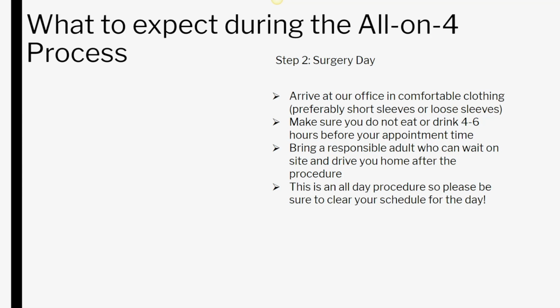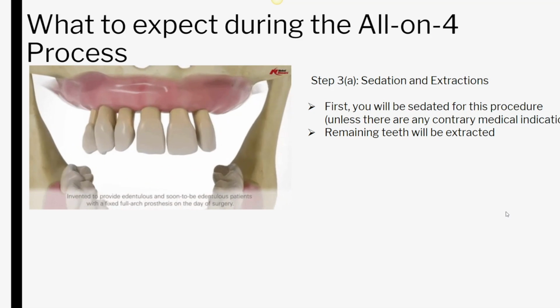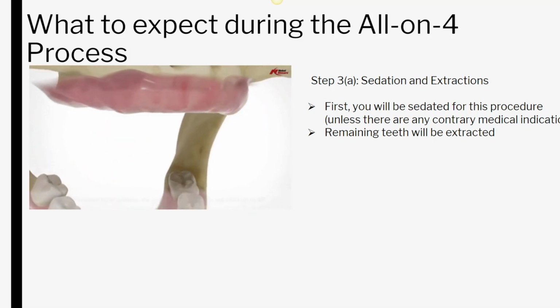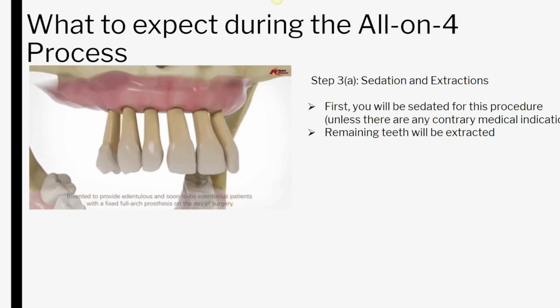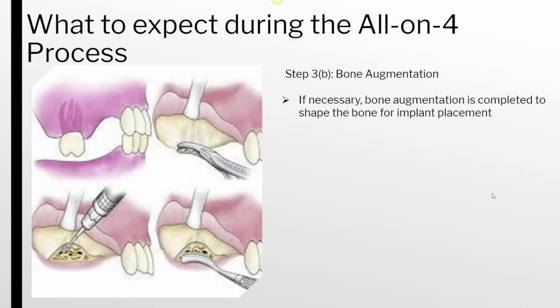Essentially, prepare for it to be an all-day procedure. You'll be here for a few hours because we'll be placing your dental implants and doing the conversion of putting your prosthesis or your teeth in place. So the next step would be sedation and extraction. We'll bring you in. Again, it is IV sedation. You'll be sleeping through the process, at which point we'll numb you up, take out your teeth, and then start placing your implants.